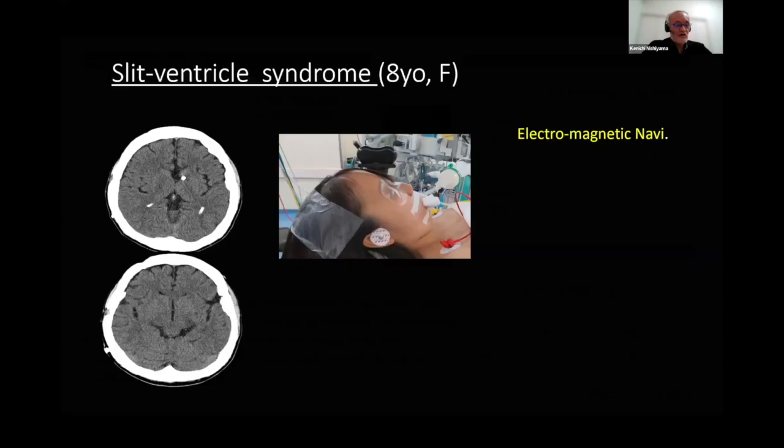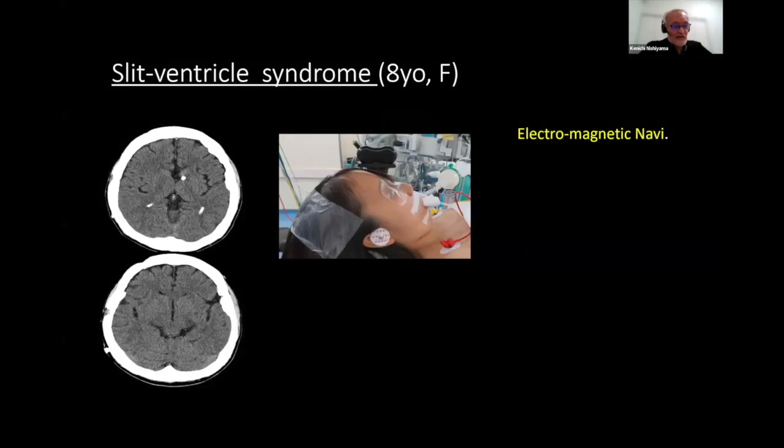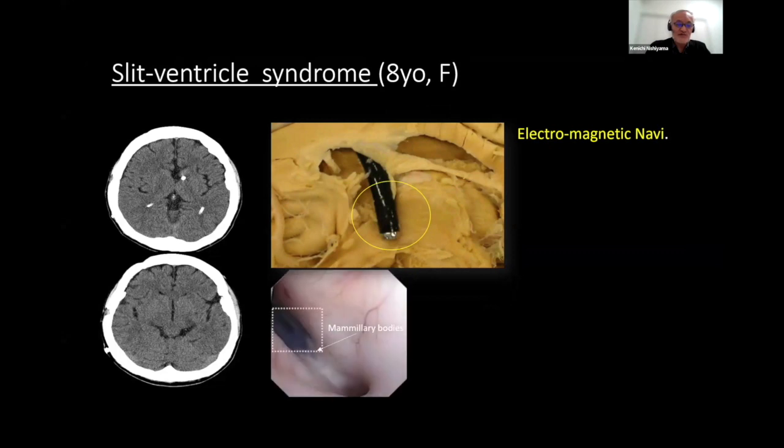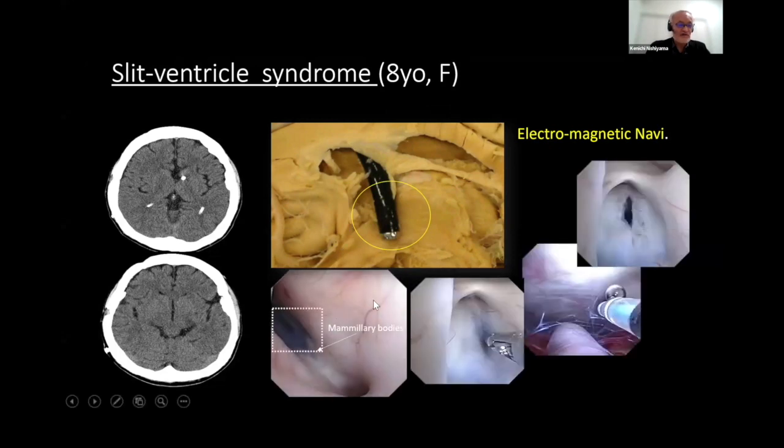One of the popular pathological states of shunt malfunction is slit ventricle syndrome, as you know. I myself always externalize the shunt at first, then open the ventricle to work with the endoscope. Basically, I use navigation or ultrasonography, and also this flexible endoscope with a soft tip to avoid injury to the ventricular wall.